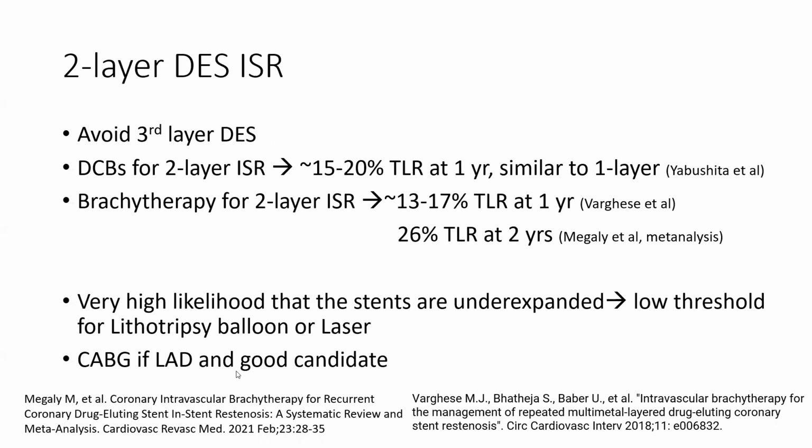So another idea here: if you have 2-layer DES, how do you treat those? I mentioned definitely avoid a 3rd-layer DES. That's a very important idea. There is very little data on the outcome of placing a 3rd-layer DES. But what we do know is that doing a drug-coated balloon for 2-layer ISR is associated with decent outcome.